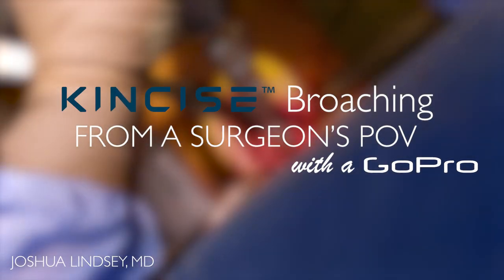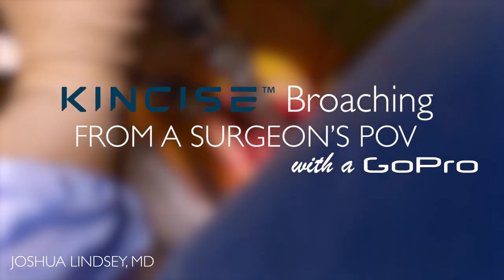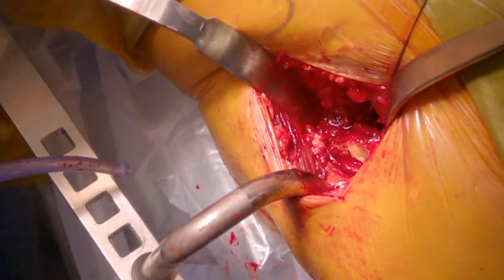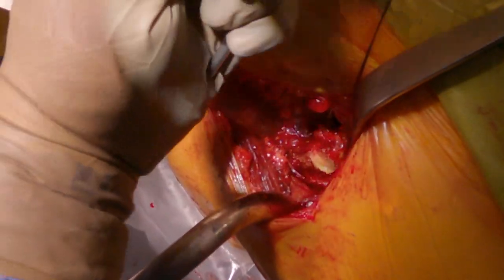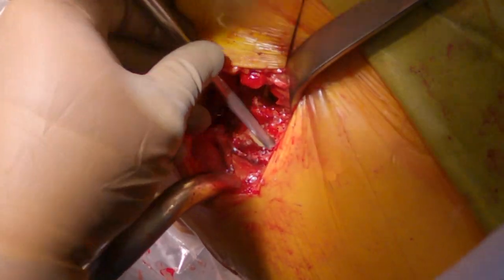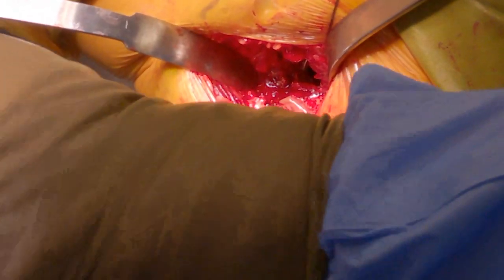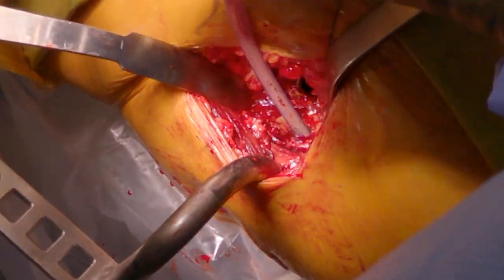This is a surgery video recorded using a GoPro, demonstrating the technique for the KINCISE system. First, you'll see a box osteotome, then a canal finding awl to locate the canal and prevent perforations. Next, the sucker is used to find the center of the canal.